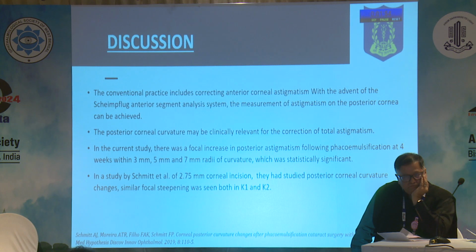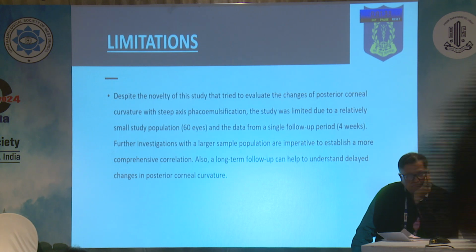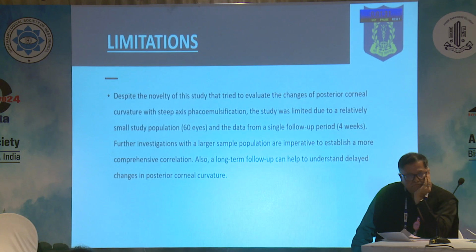As per conventional practice, only the anterior corneal astigmatism was corrected. But with the Pentacam imaging system, now we can take the posterior corneal curvature into consideration also. Studies have already started publishing which have shown that there has been focal steepening because of the effect of phacoemulsification on the posterior corneal surfaces. Now, this was a single follow-up study with a small population, so it has its own limitations. Probably a long-term follow-up study will be required to conclude concrete data.